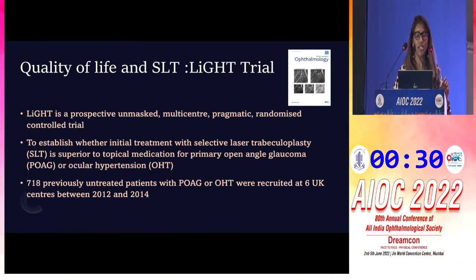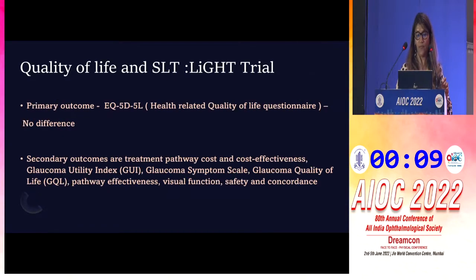Now, what has provided a leading edge to selective laser trabeculoplasty is the LIGHT trial. LIGHT stands for Laser in Glaucoma and Ocular Hypertension. This is a randomized controlled trial which compared medical management versus SLT, taking into consideration a quality of life questionnaire.